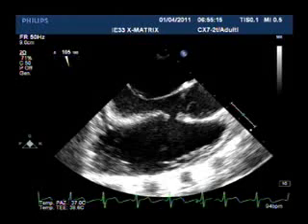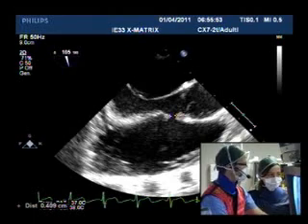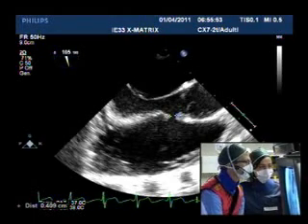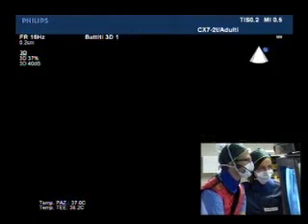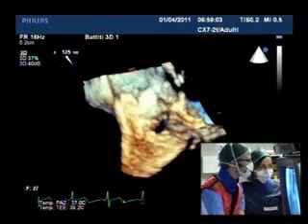So they're excellent views, and I guess the question I'd ask the audience and panel while they're getting up the 3D images. Let's have a look at the 3D reconstruction of the defect. Carmelo, please. Okay, right, let's move on to the 3D.